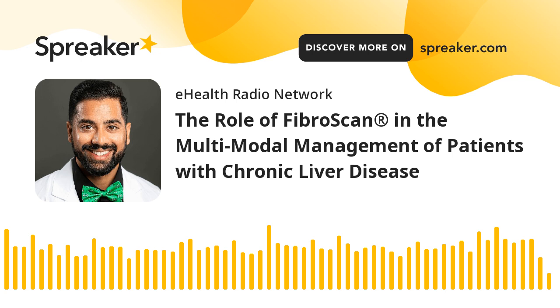I cannot tell you, Eric, how many providers, both in endocrinology and primary care, have directly messaged me, shocked, with their patients coming back with the FibroScan results, diagnosing them with stage 3 and cirrhosis stage 4, some of them with even normal liver enzymes. It's just so eye-opening to learn how silent of a disease this truly is. And when those providers truly experience this firsthand, the number of FibroScans they begin ordering and the referrals to our department as a result of this are exponential.